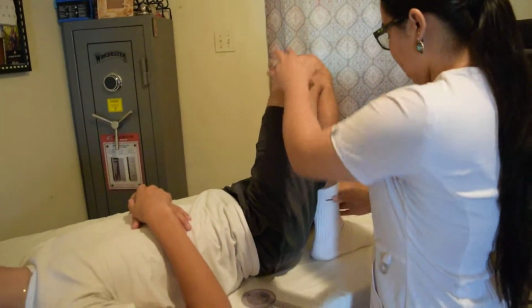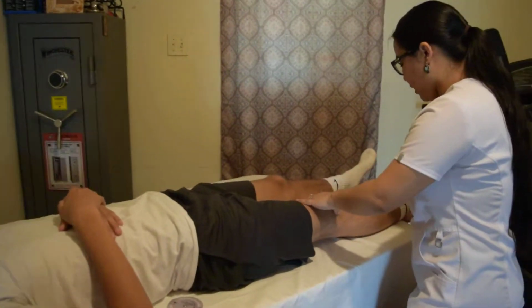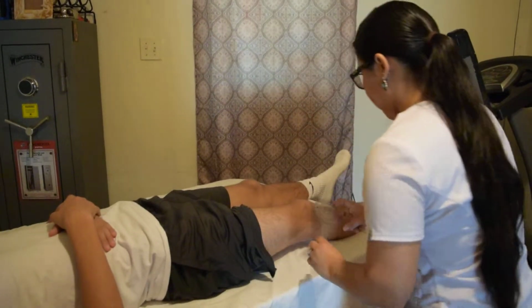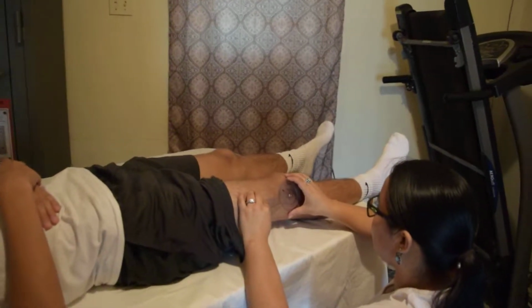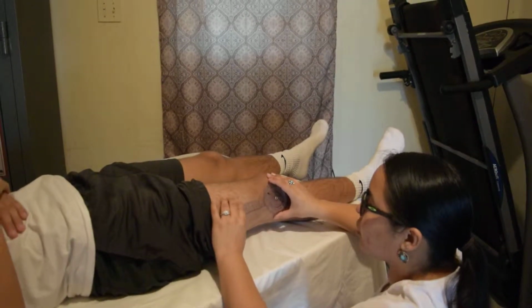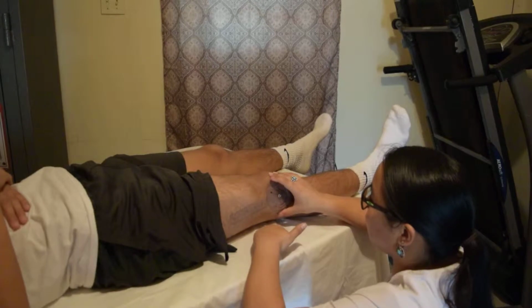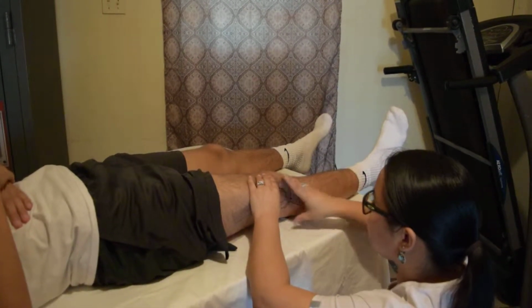So now I will help him extend his leg, and now we'll be measuring his extension. So once again, I'm going to place the fulcrum on his lateral epicondyle, and in order to measure, I will have him contract his quads or bring his knee down to the table, which will have his heel kind of rise up.